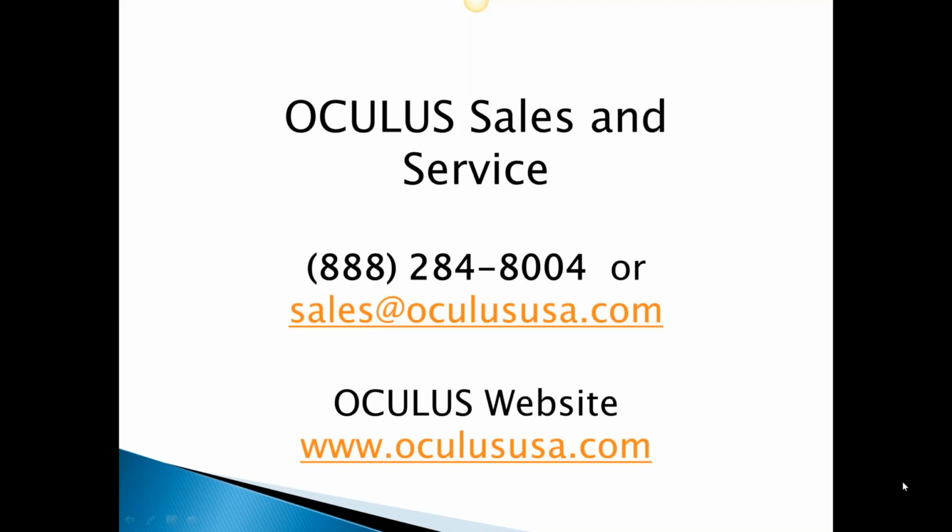Okay, thank you. Next question. They're asking, is this a Pentacam CSP report for wave lenses only? Absolutely not. It has nothing to do with wave. It plays well with wave, and that's exactly why I had put up the slide.